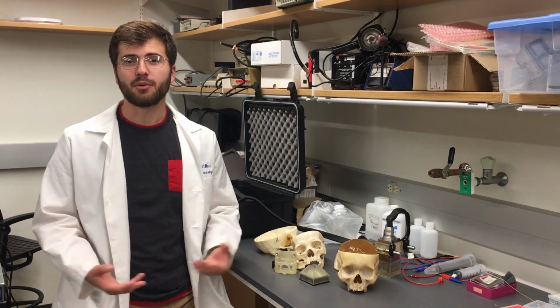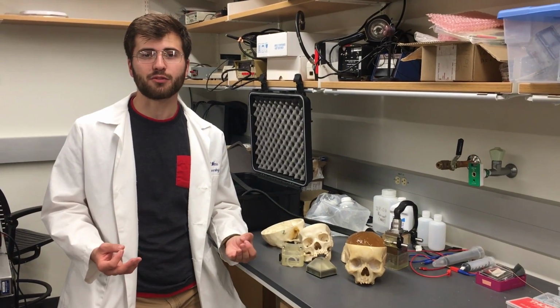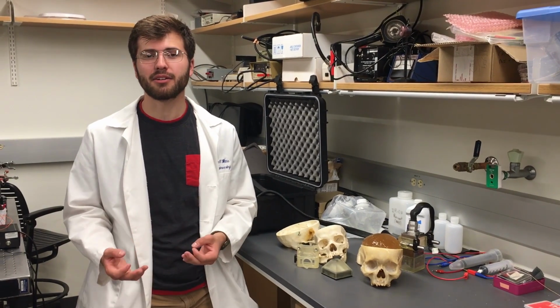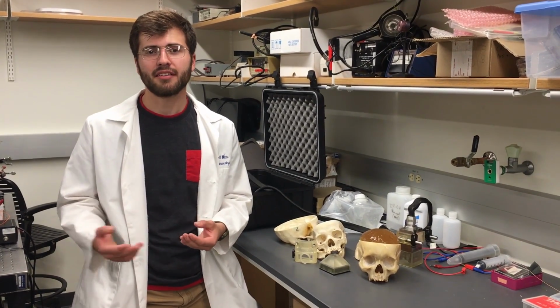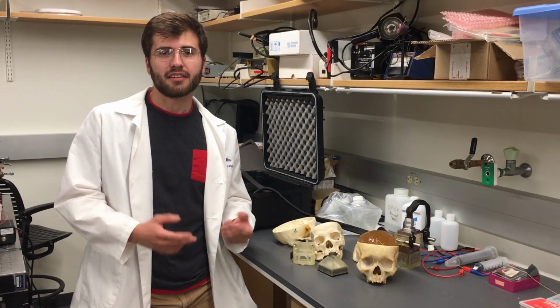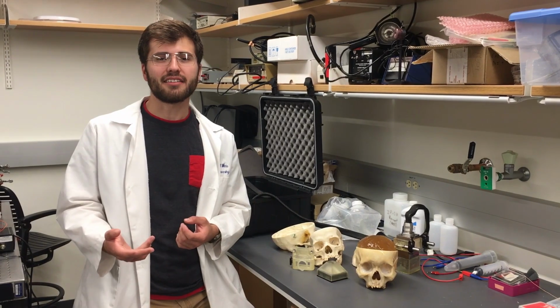However, with ultrasound, we can decrease imaging costs, increase availability without worry of magnetic interference, and the results can be instantaneous. Therefore, our specific team's main goal is to map electrical currents in the brain and elsewhere in the body using the acousto-electric imaging effect to identify structures, limit invasion, and characterize the current density shape.